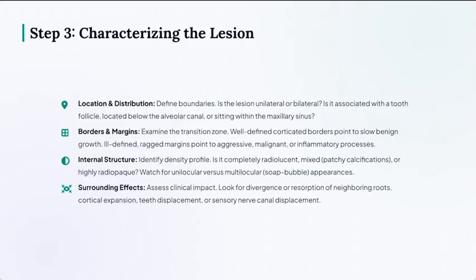And then characterization of the lesion. First, you have to identify the location and the distribution of that lesion. Define the borders, whether the lesion is unilateral or bilateral. Is it associated with a tooth follicle, located below the alveolar canal, or sitting within the maxillary sinus?